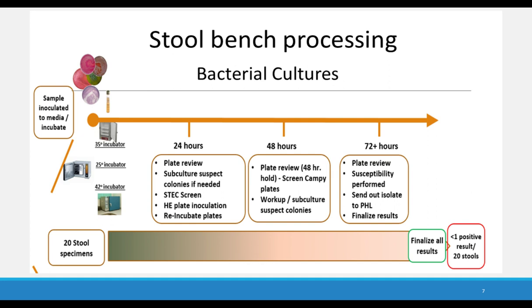This could go to 3 days or longer for all the subculturing, the workups of suspected pathogens, the possible susceptibility testing, and preparing organisms for the send out to public health department. So this could be up to 72 hours in time, and of 20 stools, we're lucky if we have one positive with all of this work.